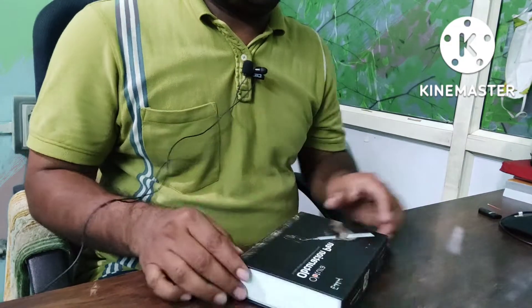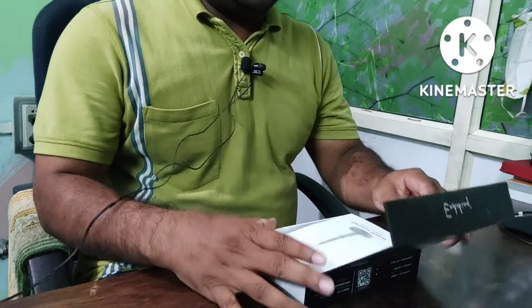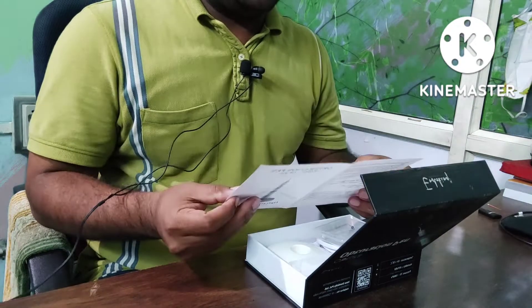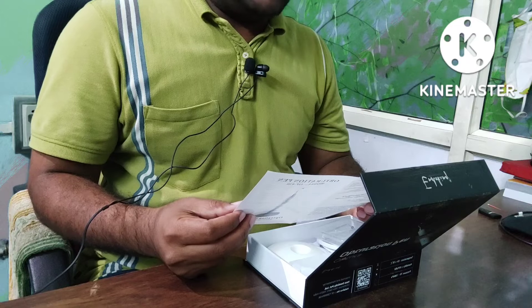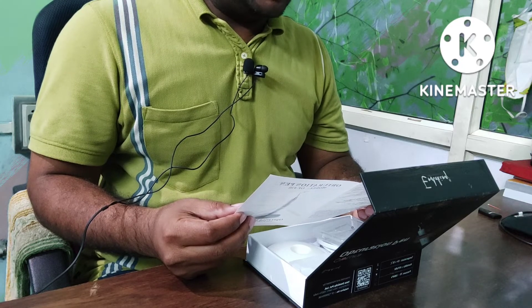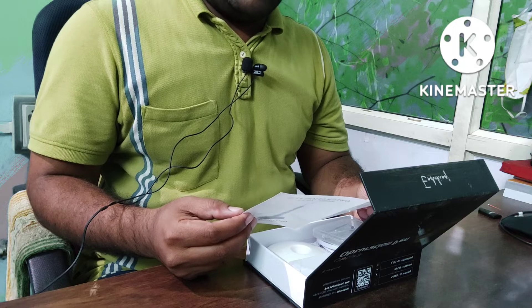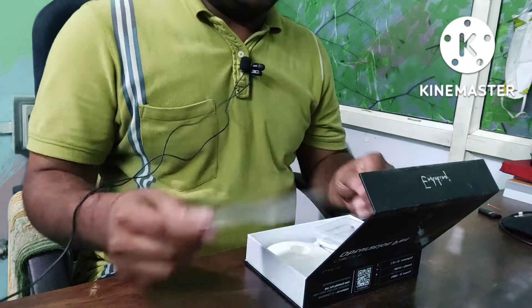This is very nice packing. On opening this, you will get a manual. This is the manual. Here the instructions are given — how to loosen, how to tighten, and the parts which we are getting with it. There is a charging base, the obturation pen, and everything is there.